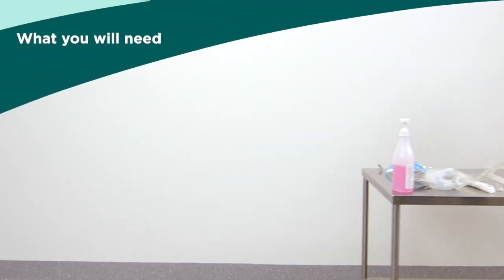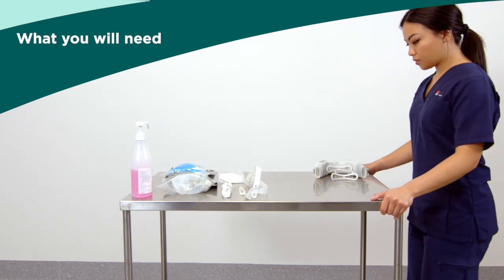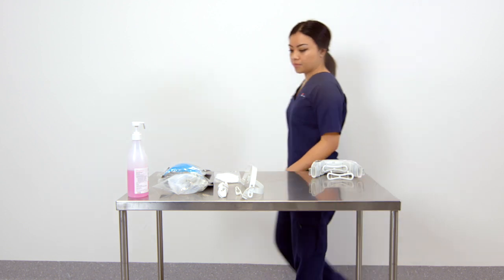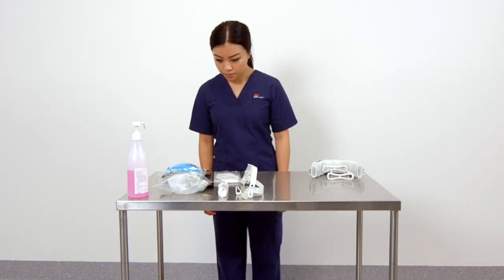Place the CleanSpace Halo power unit and accessories on a trolley and wheel to the ante room or exterior of the patient's room. It is the responsibility of the wearer to select the appropriate accessories and settings as per their fit check.